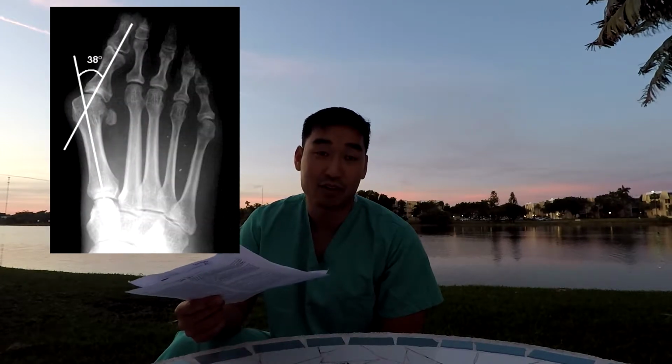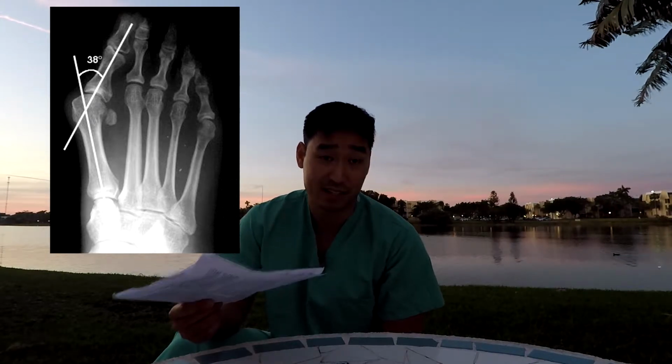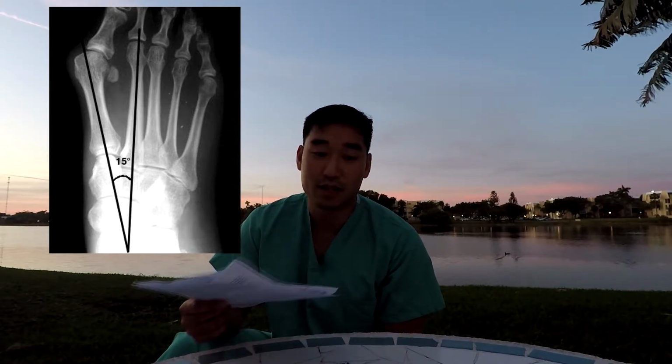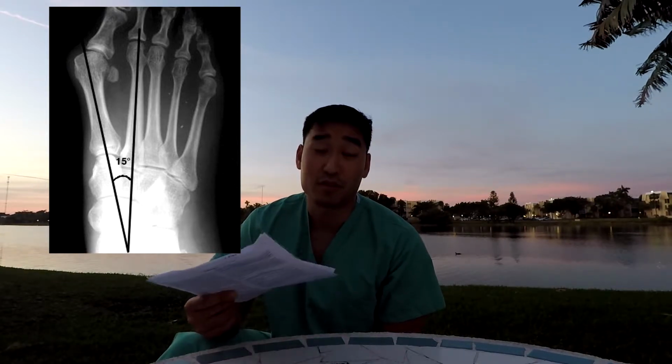So they got 2 readers to read the image and calculate the Hallux Valgus angle and intermetatarsal angle. And those 2 angles are classically used to evaluate bunions. Hallux Valgus angle is the angle of the first proximal phalangeal joint from the first metatarsal and how much angle it deviates. And generally, anything less than 15 degrees is considered normal. Intermetatarsal angle of the first metatarsal and the second metatarsal is used along with the Hallux Valgus angle to diagnose bunion, and the intermetatarsal angle should generally be less than 9 degrees. Anything above that will indicate some sort of deformity.